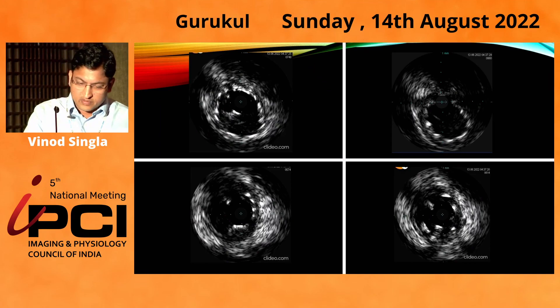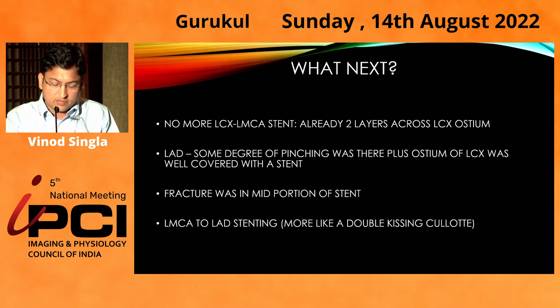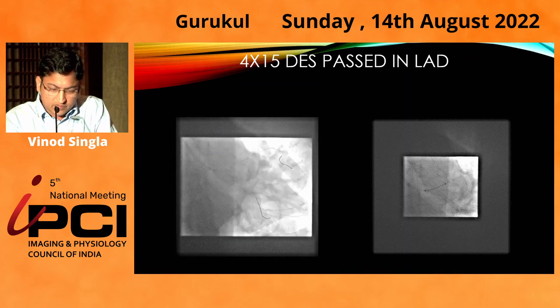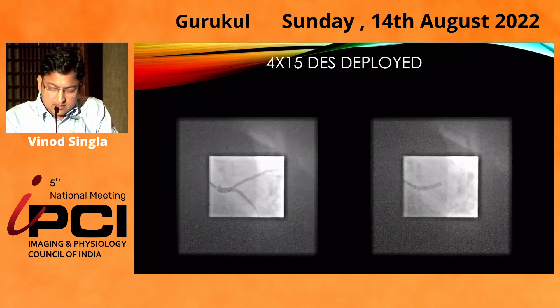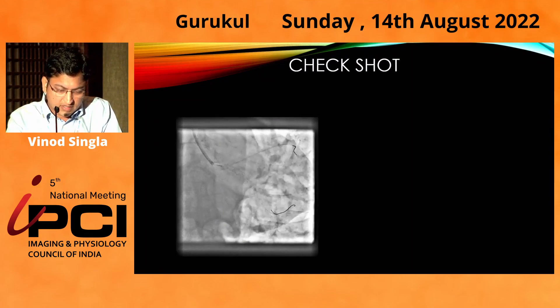The plan could be one more stent from LM to LAD, though that would create three layers as there were already two. Since ostial LAD was also diseased, we thought of putting a stent from LM to LAD — more like a double kissing crush technique. A 4x15mm stent was deployed from LM to LAD. This was the result after stenting LM to LAD.